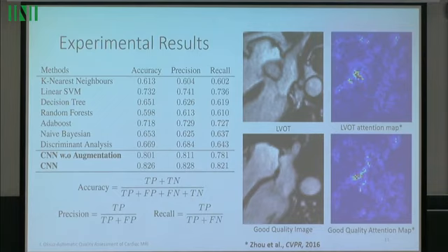The figure on the right side is an interesting one for the purposes of this workshop, because the generalizability of neural networks has been touched on by the previous speakers. Here we visualize the attention maps of the network for those 2 images. Basically, these are the gradients of the last layer of the network, and they address where the emphasis is put in order to make the classification.